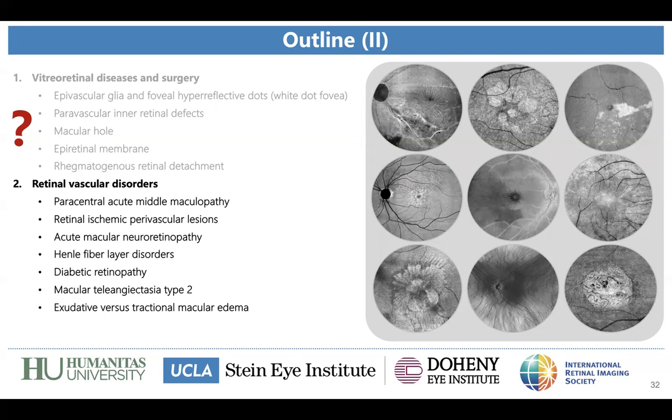Absolutely. Thanks so much, Luis. This is a very important point. I was actually unsure whether to include these slides or not, but for time reasons, I just skipped them. But maybe next time we could discuss them. So, of course, en face is fundamental also in longitudinal monitoring of macular hole and epiretinal membrane after surgery.